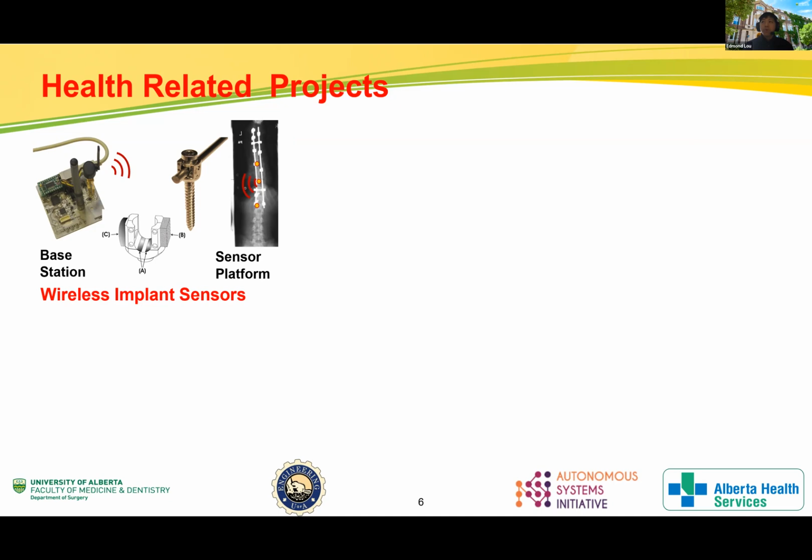In this project, we spun off to develop some energy harvester based on motion. So the whole system can be embedded inside the body and allow you to communicate between outside and inside. The sensor is embedded inside the body, and we have a base station outside, and we use the wireless to communicate between the two devices and get the information.